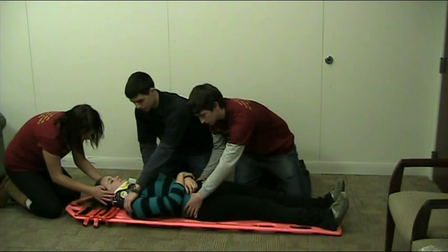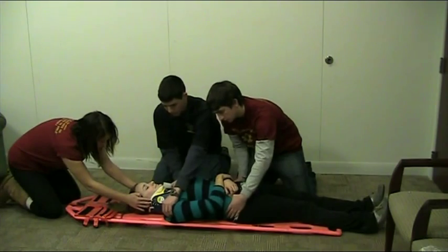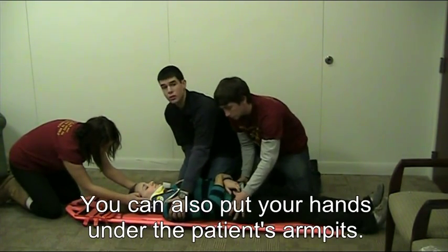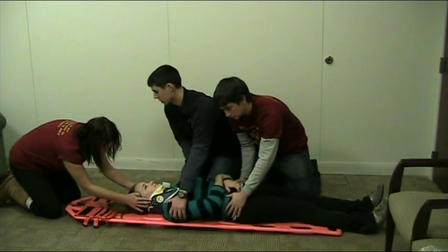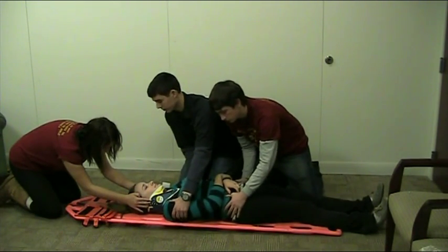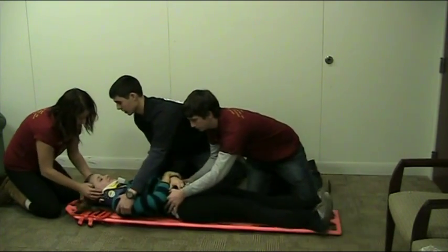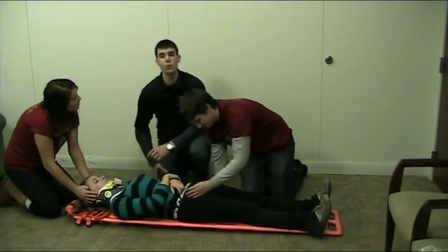Ready? Okay, Kristen, your count. Ready? One, two, three. Okay, and now I am going to move my hands, grabbing Kayla's shoulder, so that we can push upward towards the center of the backboard. Ready? One, two, three. We are ensuring that we don't grossly move Kayla's spine.